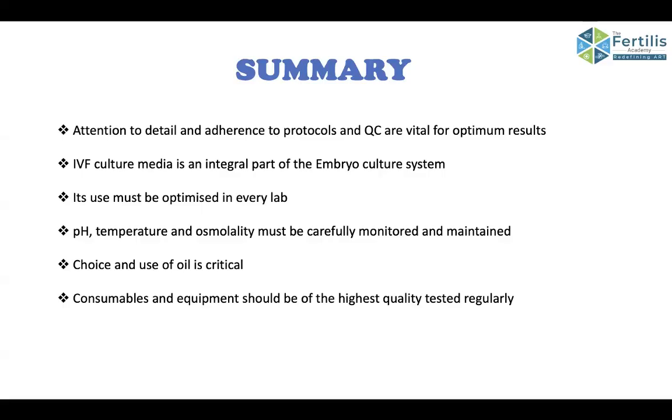So, in summary, I would like to conclude that attention to detail and adherence to protocols and quality control are very essential for optimal results. IVF culture media is an integral part of the embryonic culture system, and it must be optimized in every lab. pH, osmolality, and temperature should be carefully monitored and maintained.